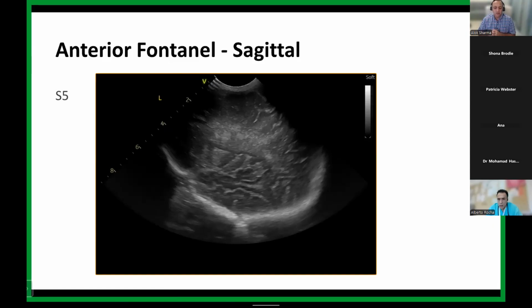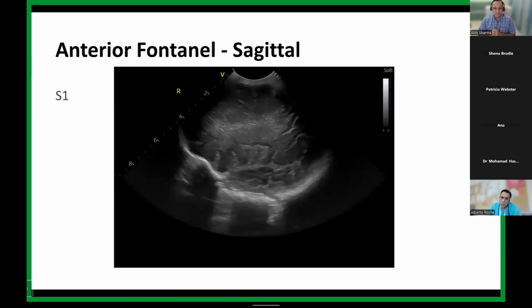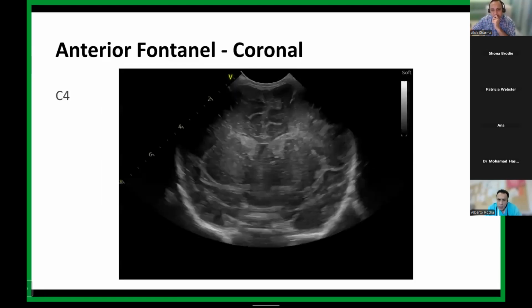Let's go back to your coronal view, Anna. So your coronal midline. Can you see that area there? Can you see the flare on that left side? It's definitely more echogenic, and this is even with the dropout. I would just worry about the flare on that left side. I definitely want to follow it up. Absolutely no doubt about it.